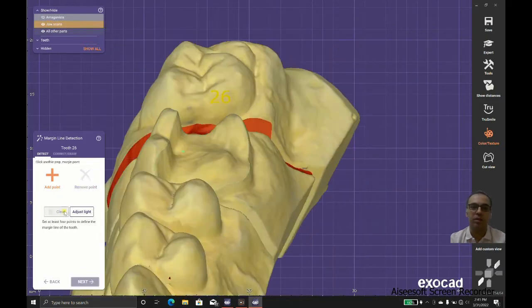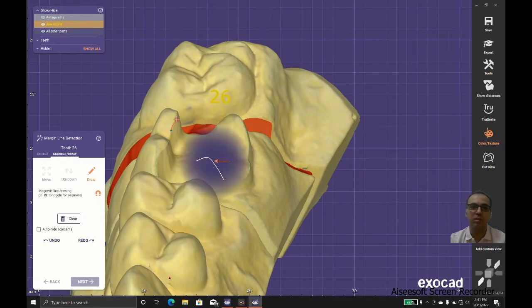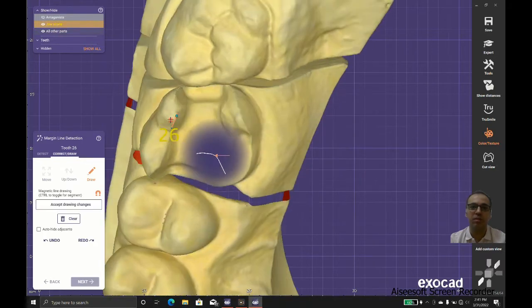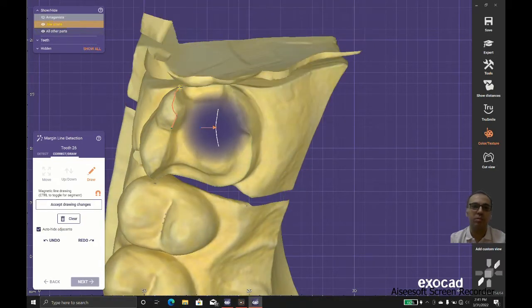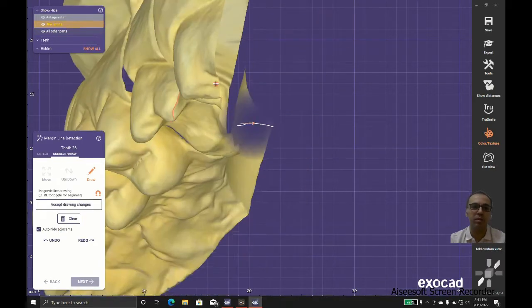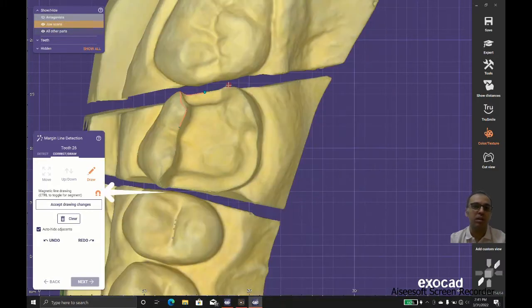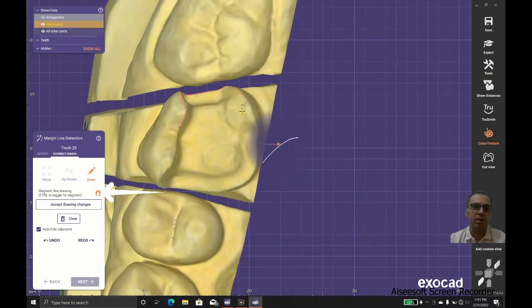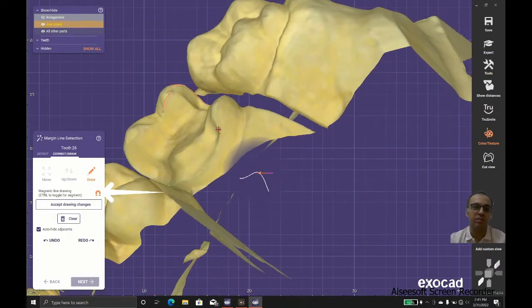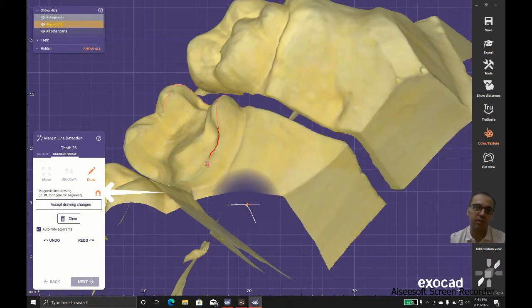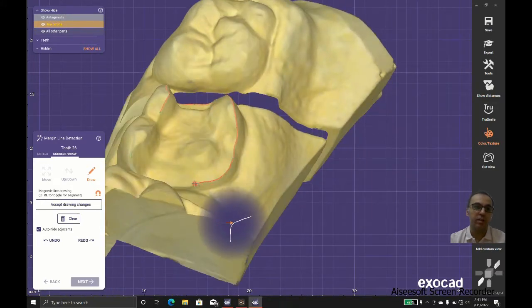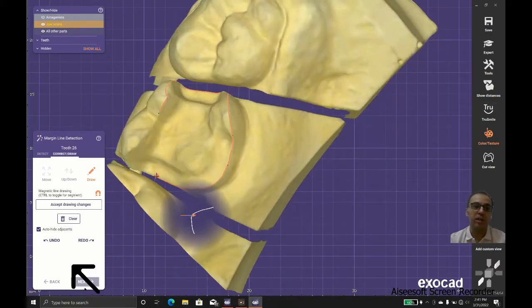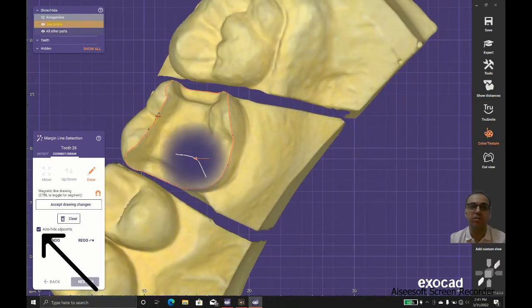The magnet helps us find the edge, and auto-hide adjacent helps us hide the adjacent parts so we could have a better view.